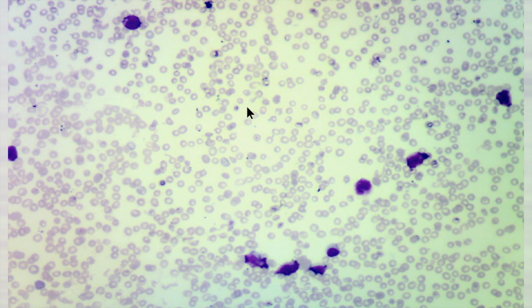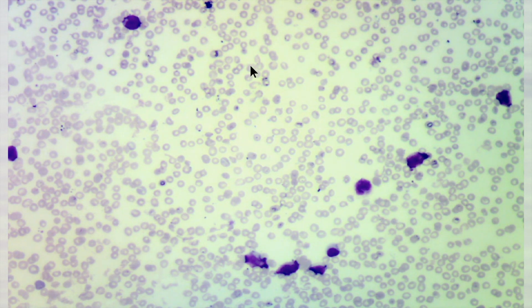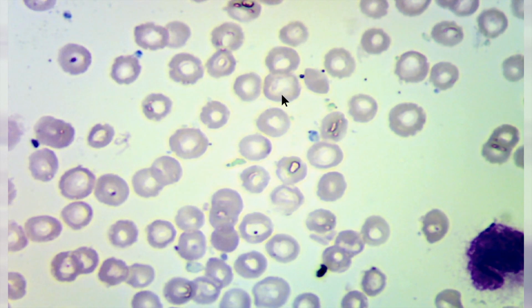There is not much that you can see, perhaps leukocytosis, an elevation in the number of white blood cells present on the film. There are some artifacts present. You should by now have a good idea what is real and what is an artifact. The smaller elements we have to look at under higher magnification, which is what I would like to do. And in here, I do see that there are some artifacts present.